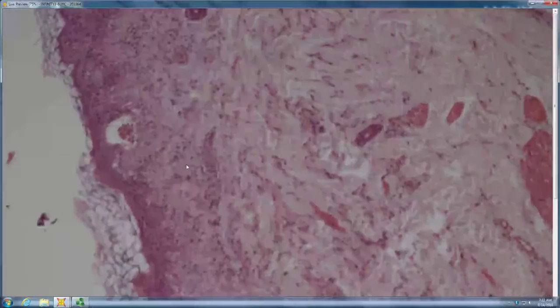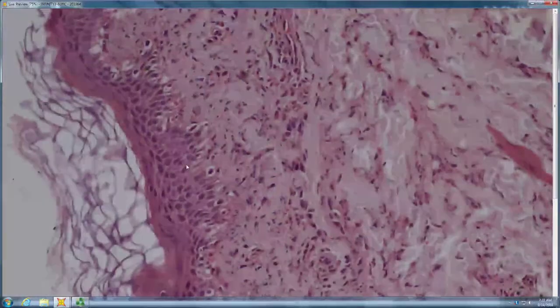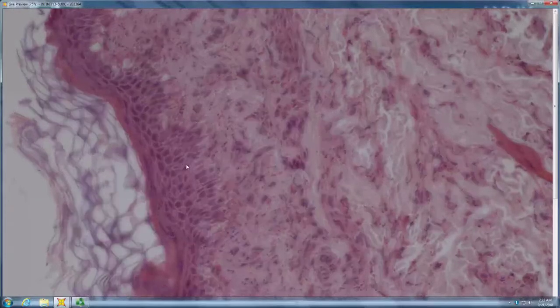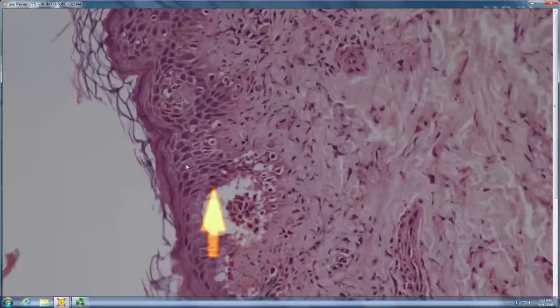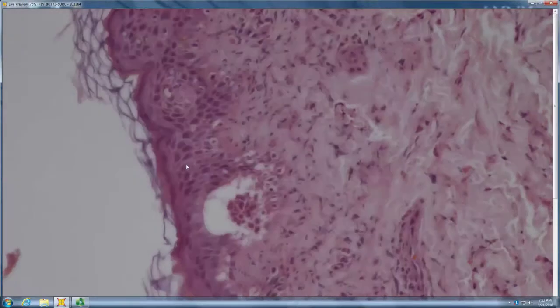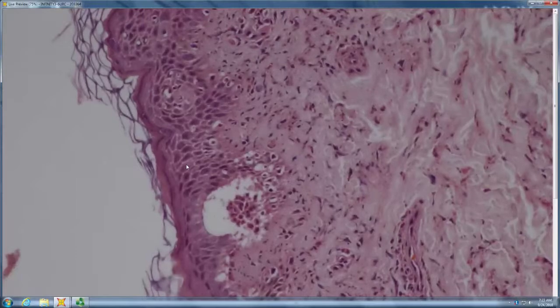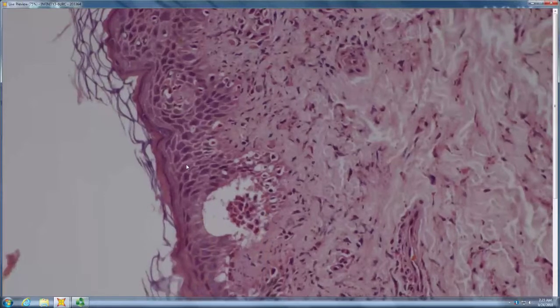So it looks like there's acantholysis or a little small blister. Kind of looks intraepidermal, maybe subepidermal. They look like maybe there's some neutrophils in there. Yeah, so there are definitely some neutrophils, and the question here, it's not clearly a subepidermal split. I agree with you that the neutrophils are kind of sitting within the epidermis, not necessarily high, but definitely within the epidermis.